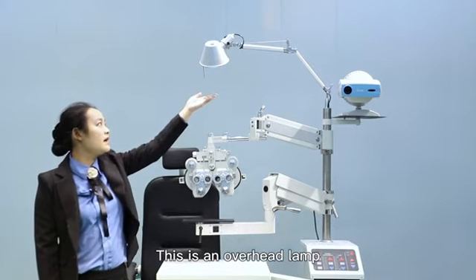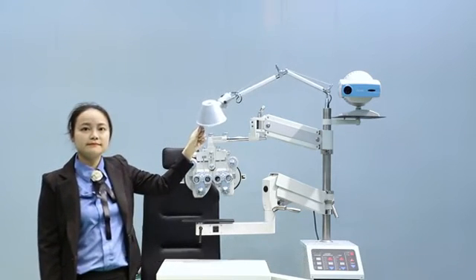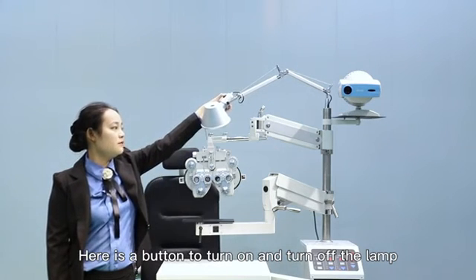This is an overhead lamp. We add a grabber to adjust the lamp. Here is a button to turn the lamp on and off.